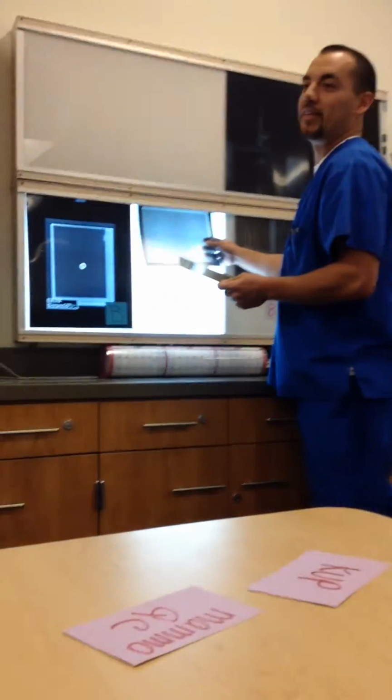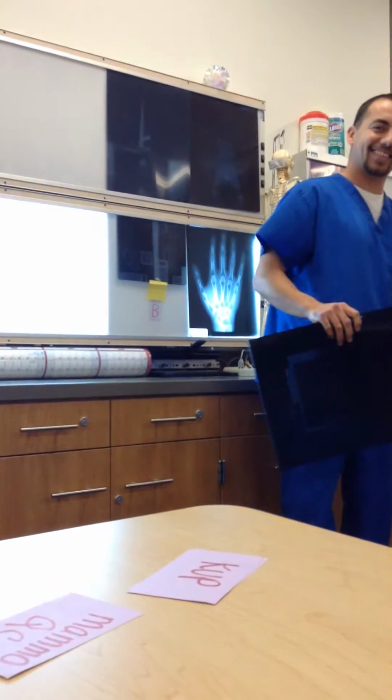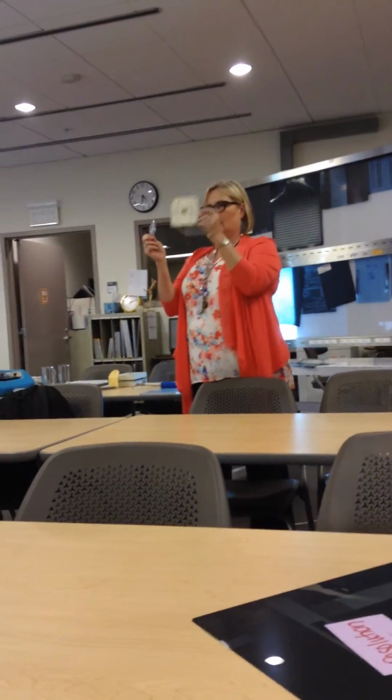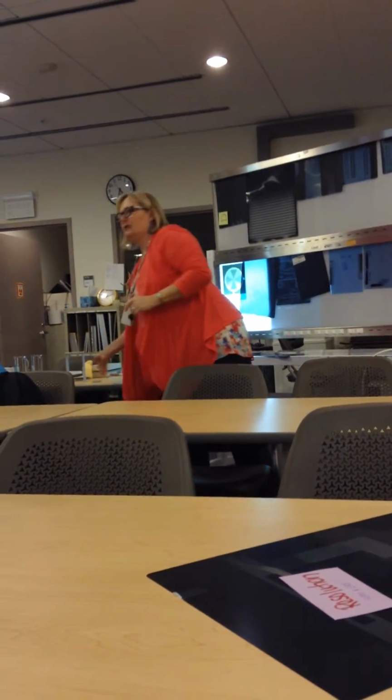And then these two I didn't give to anybody. These are focal spots here. This is the star test. And this is the other one, the line pairs per millimeter. And what was the third type that we test the focal spot with? So we have the star pattern, the line pairs per millimeter, and the pinhole camera. Right, good. Okay, who's next?